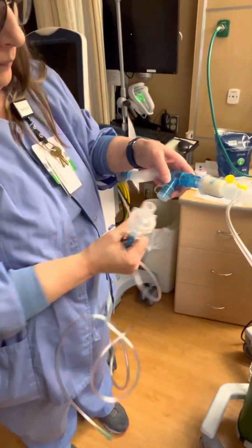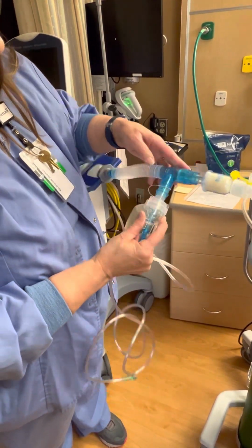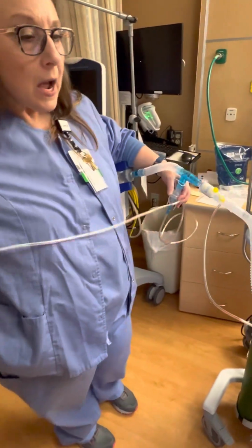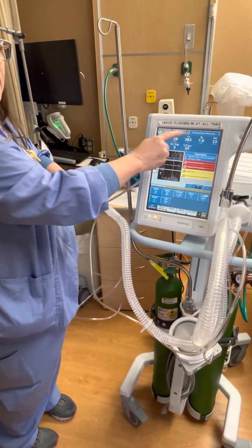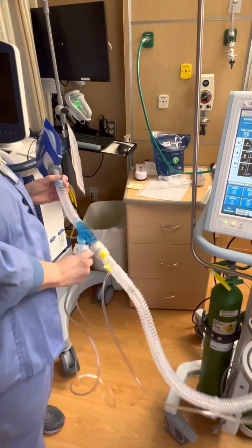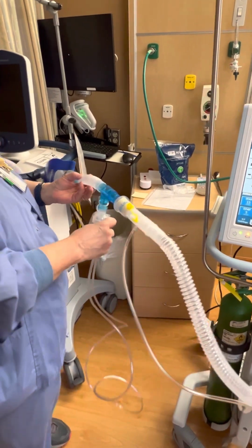You take your neb, you open the cap, and you push this in. And when you push that in, it opens it up here. You run it off the wall, just like you would do a regular neb. Now, it might drive your pressure up a little and your tidal volume up, so just keep an eye on that. But you just do your neb, otherwise just like normal. But you can see how it would give it a better angle with the hose. You have it in the kit, you might as well use it.